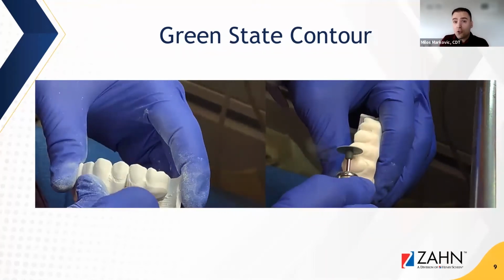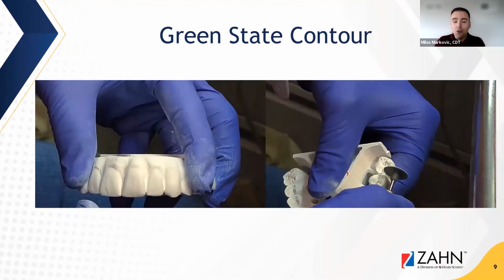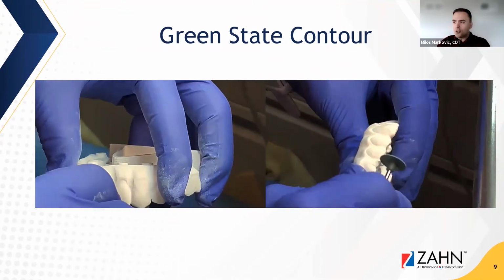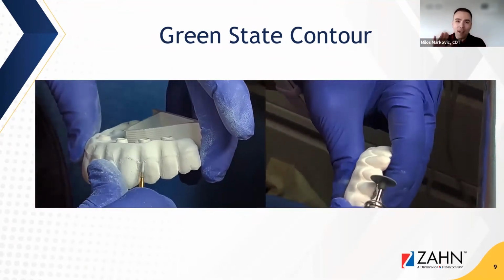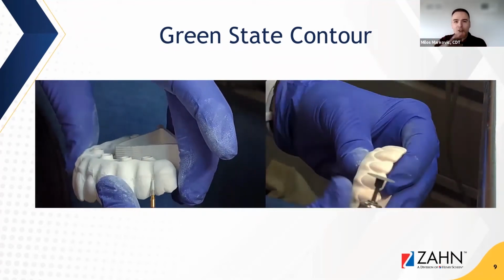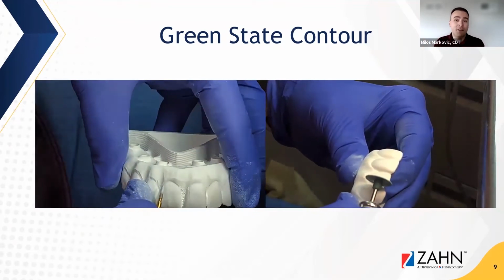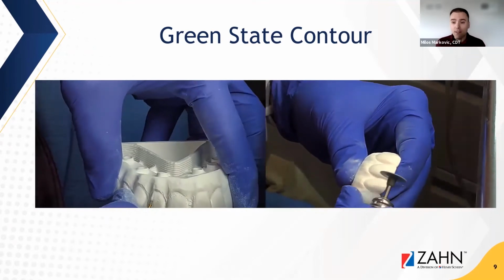And all the research so far has shown us that once you sinter zirconia and start grinding on it, you're really reducing its properties, you're diminishing its properties. So if your zirconia is rated at 1200 megapascal, you're bringing it down. Each time you grind on it and you see those sparks flying off of your green disc, you're going 1200, 1100, 900, 700. You just keep killing that zirconia's strength. So really the way to go is to do it in green state.